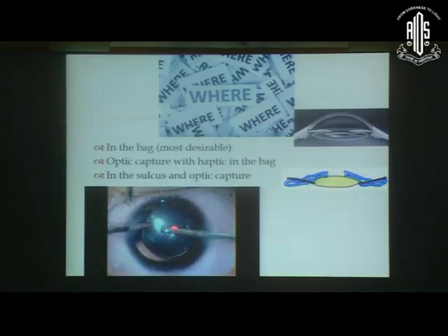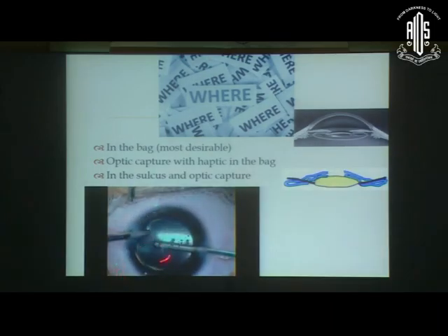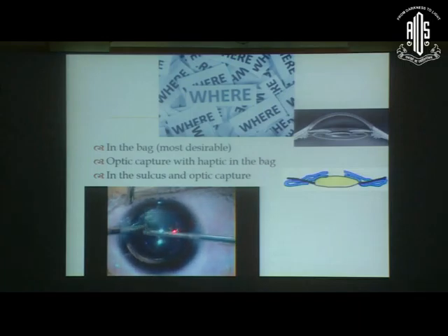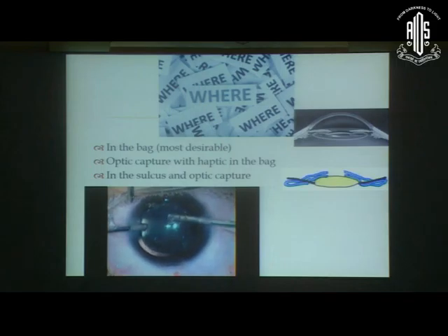This is just another video where we are doing a vitrectomy. I've started this very recently, so I try to put the optic behind. So this is the tug. Here it has gone behind the posterior capsule, and then finally from this side. So the optic is behind the posterior capsule, and the haptics are in the sulcus. I'm sorry. Thank you very much.